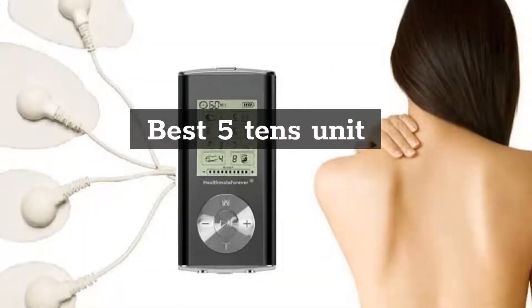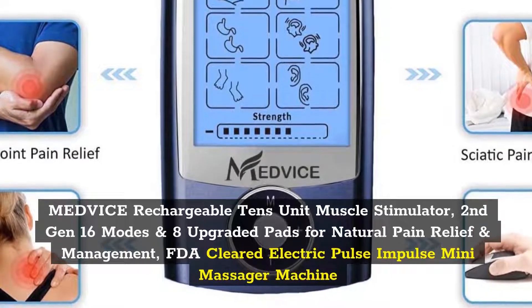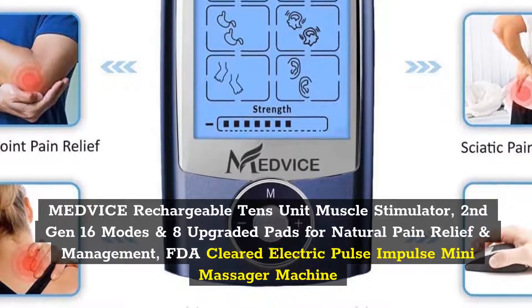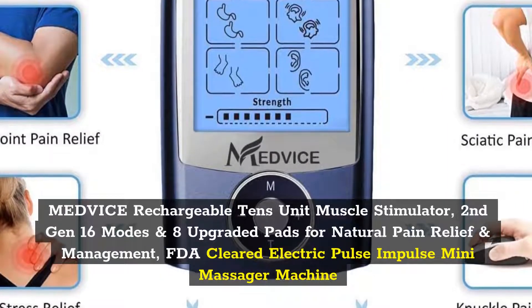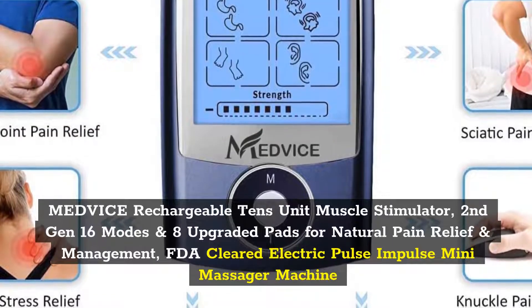Best 5 TENS units. Number 1: MedVice Rechargeable TENS Unit Muscle Stimulator, 2nd Gen, 16 Modes and 8 Upgraded Pads for Natural Pain Relief and Management, FDA Cleared Electric Pulse Impulse Mini Massager Machine.